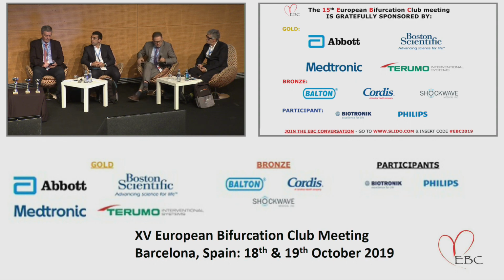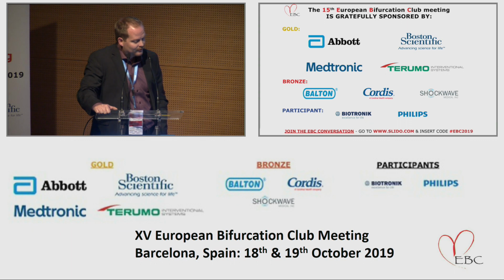Okay. Yeah. Well, from what I've heard or been told, I think imaging was used in both cases. Also initially, during the first failure case, and I think the result didn't show a completely optimal result at the ostium of the LAD, but they did use the appropriate sizing, 3.5 non-compliant for kissing, and also for the drug-eluting balloons. So I think size-wise, yes, but perhaps the laser helped to get that some underexpansion away in the LAD.